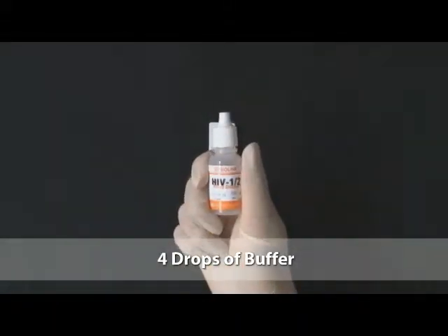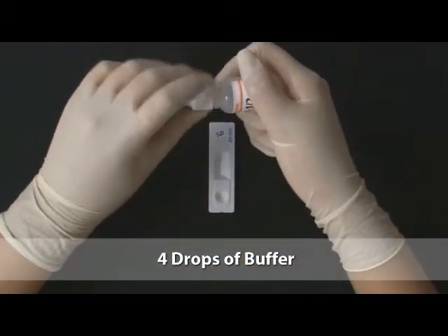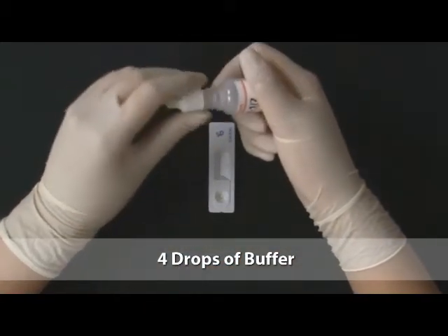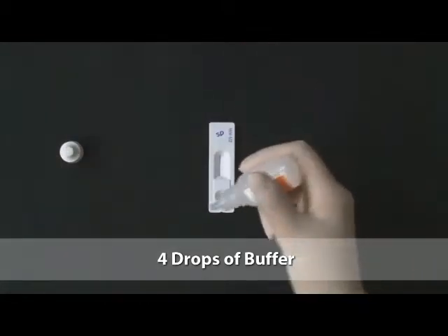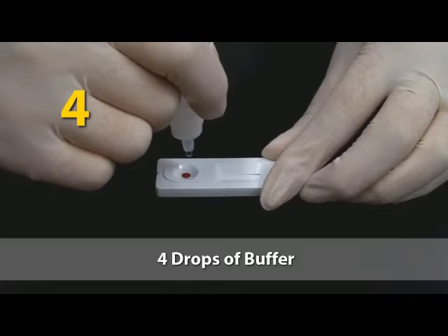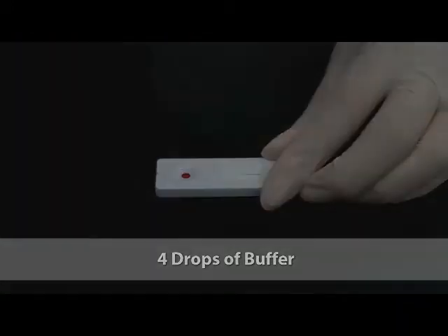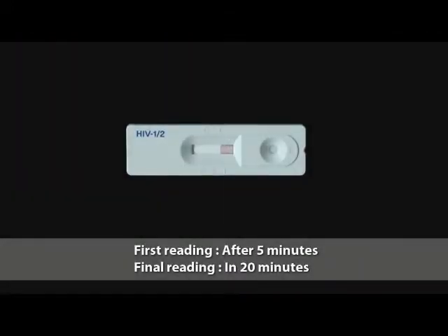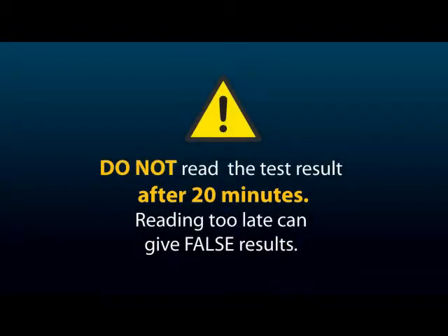Add 20 microliters of drawn blood into the round sample well, then add 4 drops of buffer into the same round well. Read the result after 5 minutes initially; for clear interpretation, read the result at 20 minutes. Do not read the test results after 20 minutes, as reading too late can give false results.